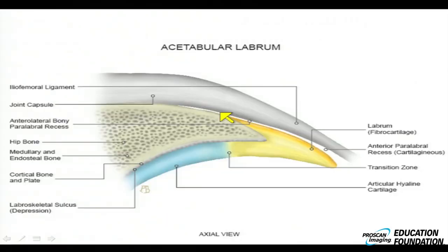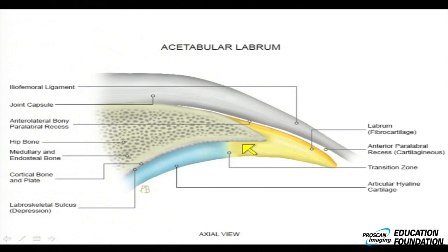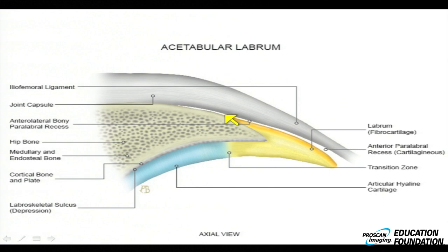Let's look at our labral anatomy for a moment. We have the bony acetabulum, the medullary bone, cancellous bone, and the surrounding cortical bone. Peripherally, the fibrocartilaginous labrum has a smooth transition to the hyaline articular cartilage, where marginal erosions may be seen with shearing phenomena. Superolaterally, the iliofemoral ligament and capsule is tightly attached to the acetabulum, no more than three to four millimeters above the reflection of the labrum, where there are some normal depressions and irregularities.